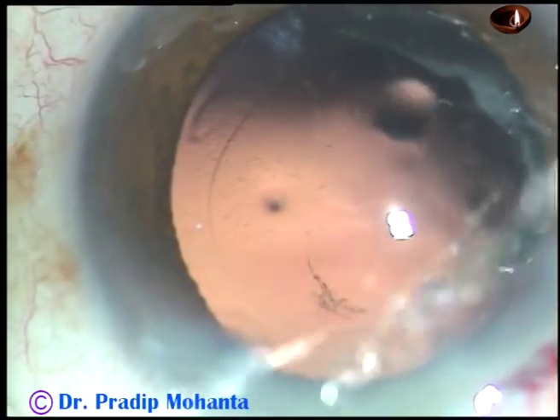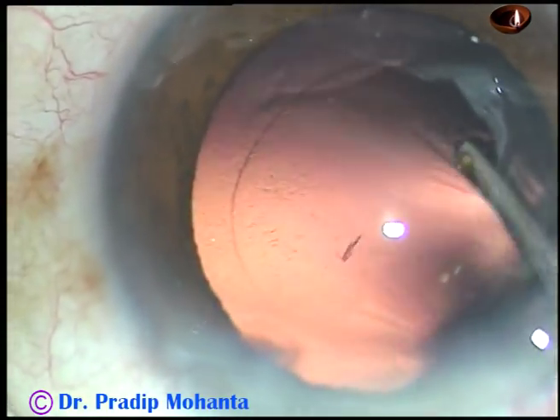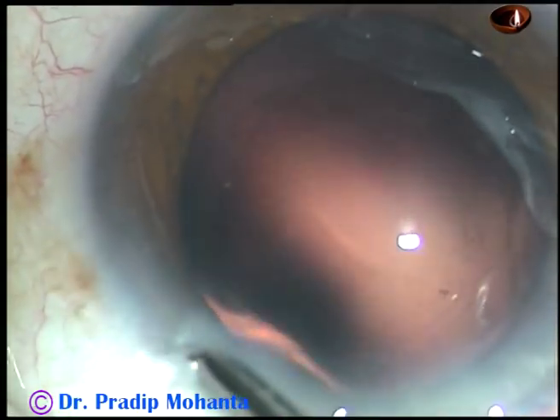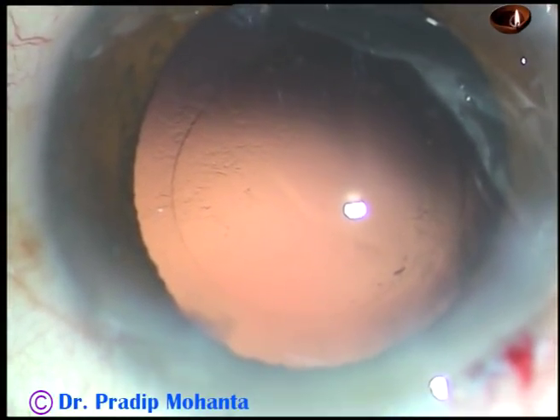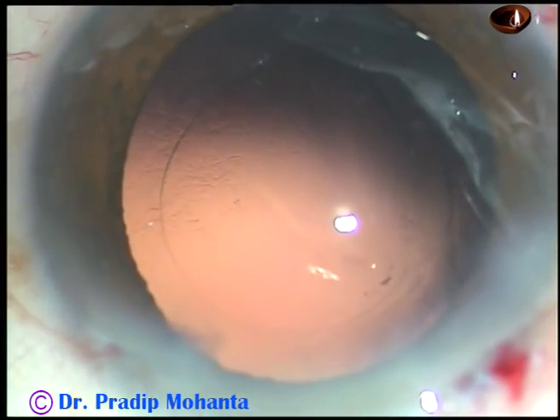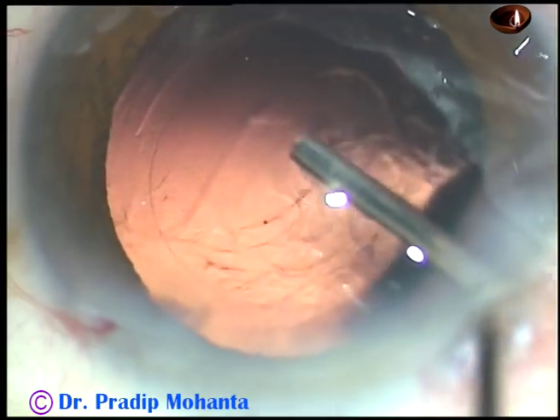And now, this is a bit of hydro polish. The fluid jet is swept over the posterior capsule, the lens fibers get dislodged, and the posterior capsule gets nicely polished.